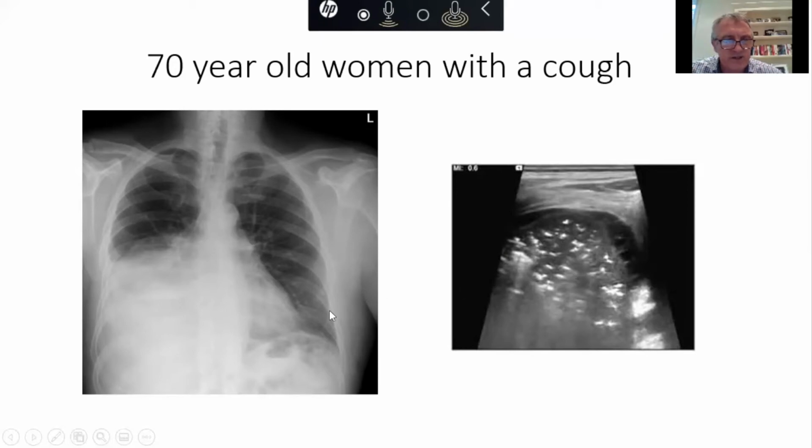So on this chest x-ray, the differential is possibly effusion or consolidation. And if it's an effusion, it's infection or malignancy or tumour. And we've actually just converted this into the correct diagnosis of infection, and most likely to be bacterial. Now we see the branching structures here. This is air within the bronchi. So we're seeing the same anatomy and pathology on a different imaging modality. If you had your stethoscope here, you'd hear bronchial breathing, transmission of large airways. But what we're actually seeing is the air bronchograms here.